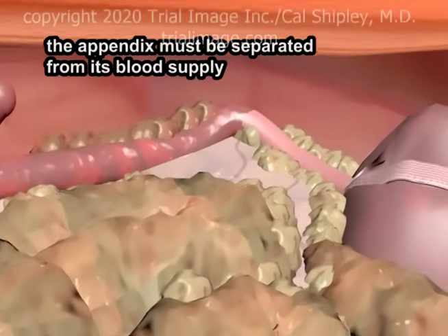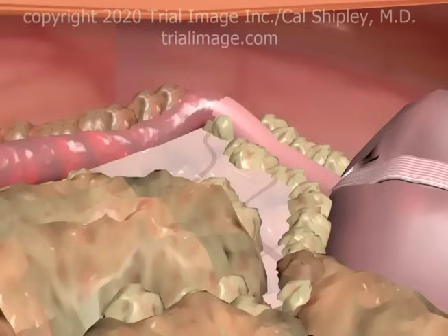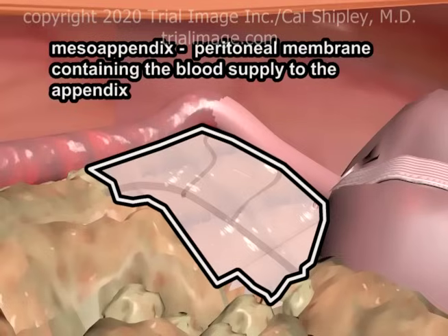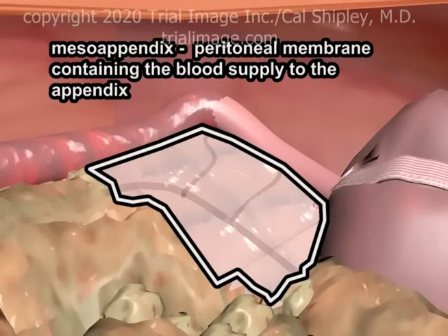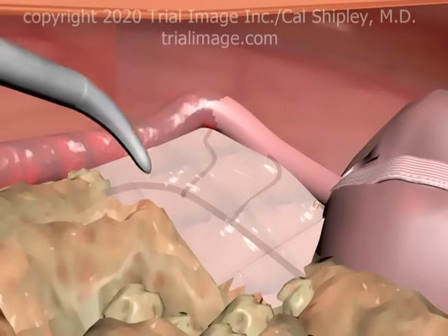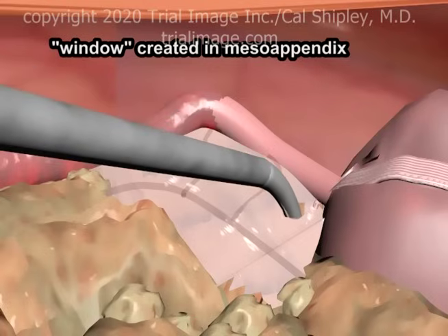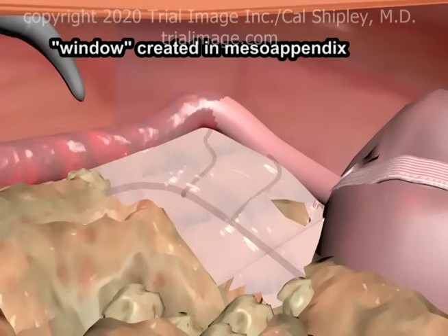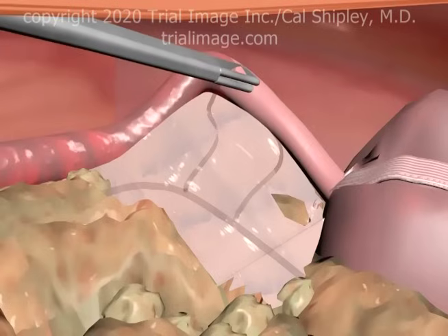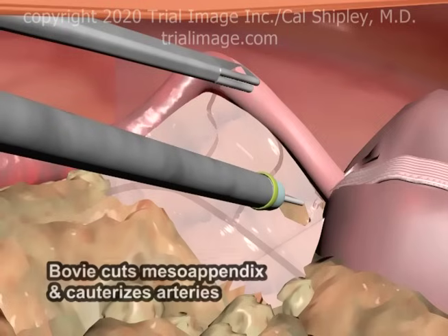Having identified and exposed the appendix, the next step is to separate the appendix from its blood supply. In order to accomplish this, it is necessary to fully expose the mesoappendix, which carries the appendiceal artery and its tributaries. Typically, a blunt instrument is used to create a window or hole in the mesoappendix membrane. A bovie electrocautery unit is then used to cut the membrane, coagulating any vessels it encounters as it moves along.